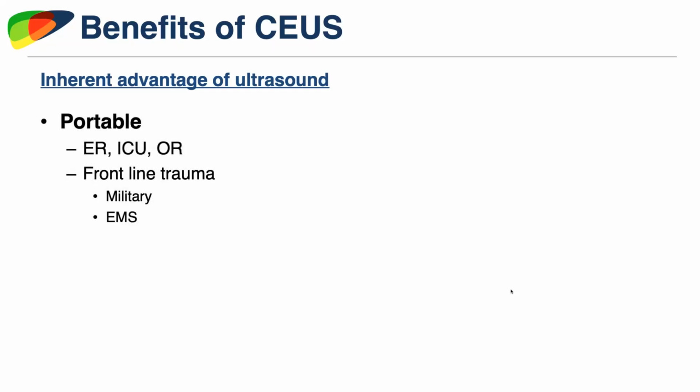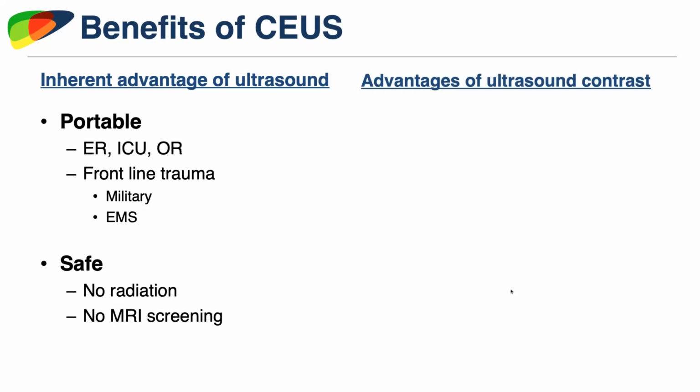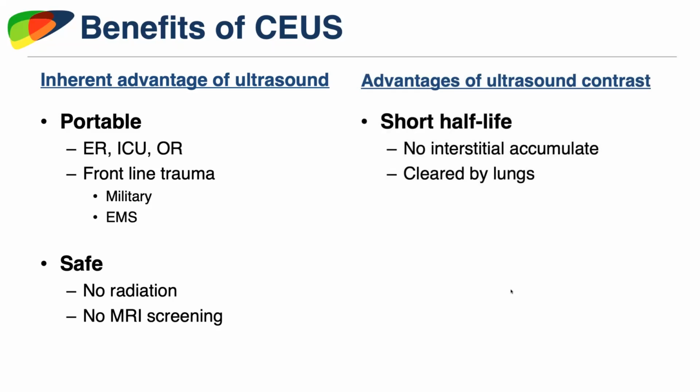So to round out my advocacy for contrast-enhanced ultrasound, here are some of the benefits. You are able to leverage some of the inherent advantages of ultrasound. You're portable. So we've gone and done exams in the ER and ICU and OR. There's been talk of using contrast-enhanced ultrasound in the front line, obviously not to diagnose HCC, but of course in trauma situations, for instance. Obviously, it's a safe modality, right? This is one of the biggest benefits of ultrasound. It's very approachable. There's no screening involved. There's no radiation involved.